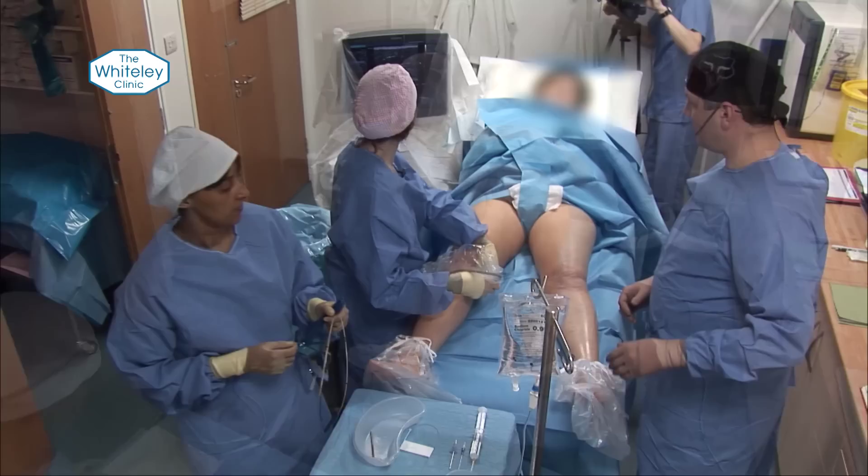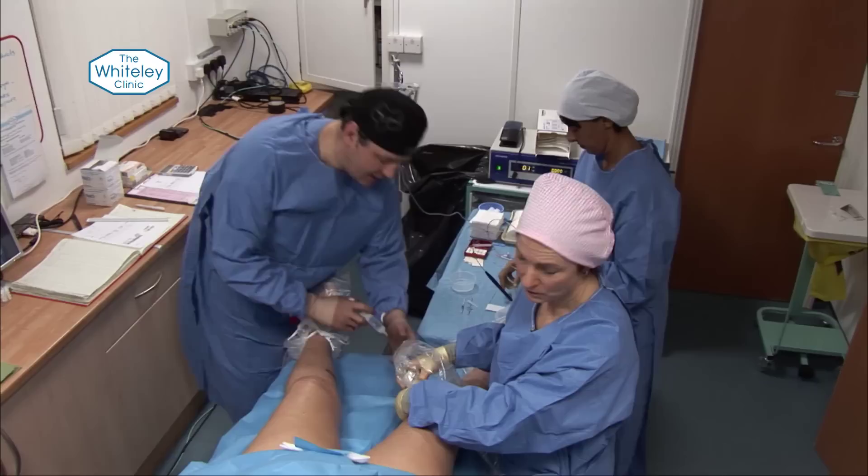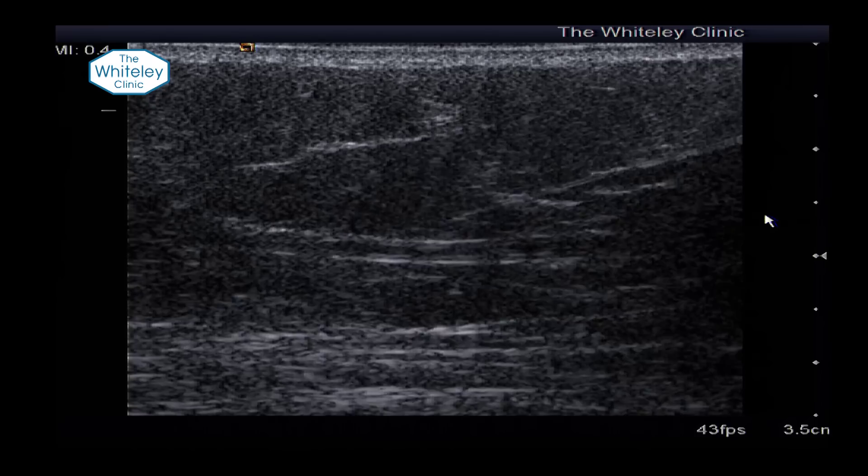The first thing we're going to do is put in some local anaesthetic. We have to do this in line with the ultrasound — in line with the longitudinal axis of the ultrasound probe — and we can now see it on the screen. We're coming down and you can see the vein is actually very small and atrophic at this point.